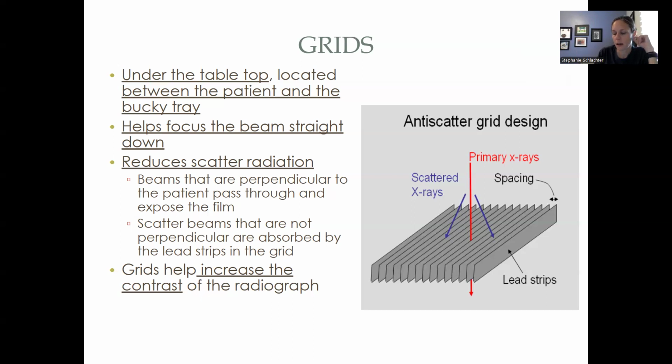Think of it as when you are taking a picture and you kind of have that sunbeam coming in, right? It's not actually part of the picture, like somebody's face or something like that, but it is affecting what that image looks like. Obviously, a lot of people like to add it for kind of that cool effect. But if you're just trying to get what's in front of you, like somebody's face, you don't want that there, right? It affects the overall quality of the image. Okay. So kind of think of it as trying to block that out is what the grid's trying to do.